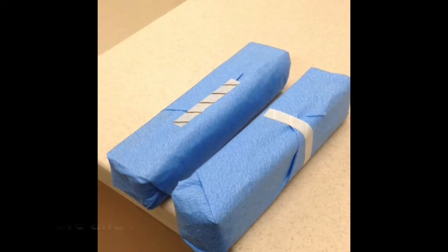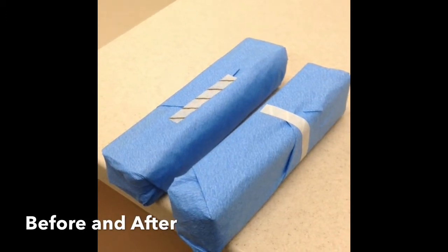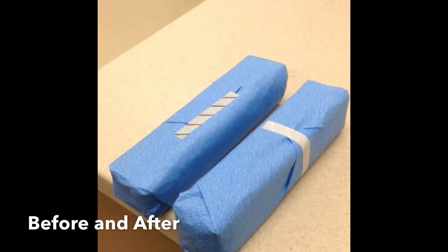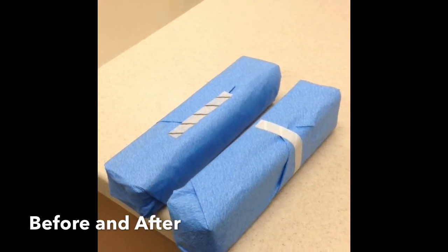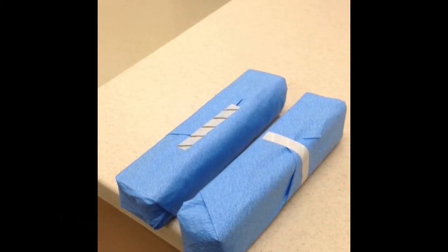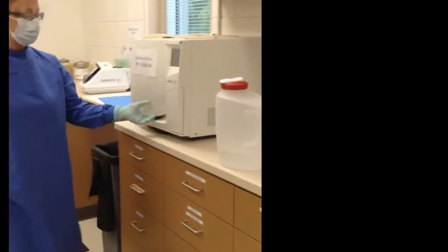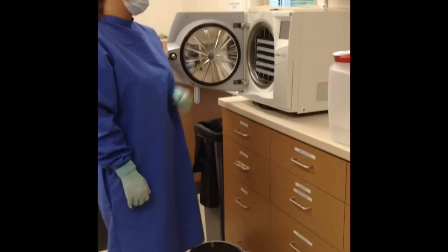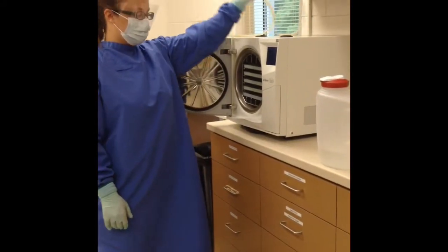We are showing you an instrument case that has been processed and one that has not. The instrument case on the left has a chemical indicator that has turned charcoal gray-black to show that the outside of the case has reached the desired temperature. While the autoclave is running, Krista is going to show us how to run the Lisa. The Lisa is only used for hand pieces and burrs.